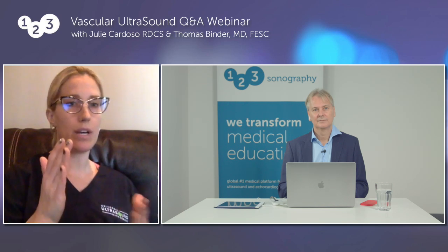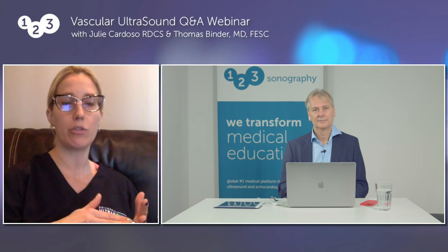Mm-hmm. And if you use a pulsed wave Doppler, you can probably see that as well, right? And you can also utilize the pulse wave spectral Doppler and put the sample volume right inside the lumen, just to give you an indication of which is artery and vein. And again, the pulsatility of the artery will show up on your Doppler, where you would see the phasicity of a waveform for the venous flow. Okay.